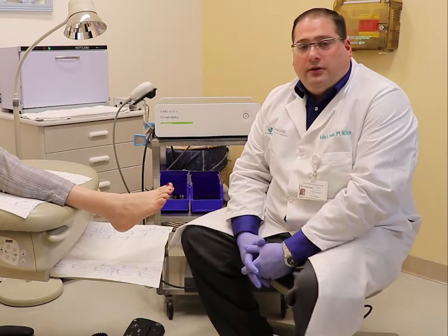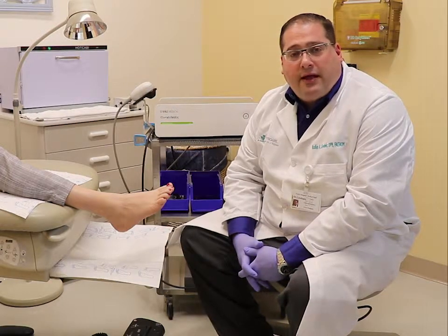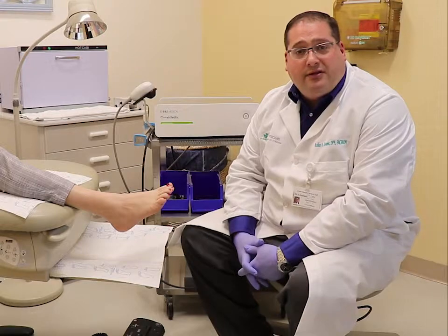Hello, my name is Bill Lerifonis. I want to discuss a little bit about the EPAC treatment that we've been doing for the past three years for plantar fasciitis and Achilles tendonitis.